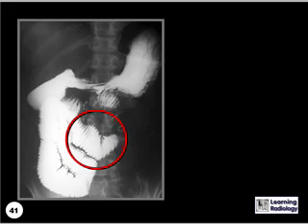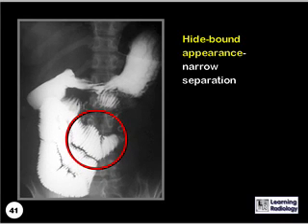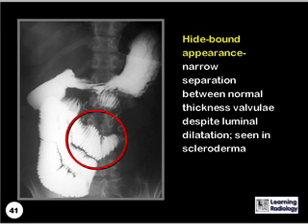What is the name given to this abnormal appearance of the small bowel? This is the hide-bound appearance, which is narrow separation between normal thickness valvulae, despite the presence of luminal dilatation, and is characteristic of scleroderma.